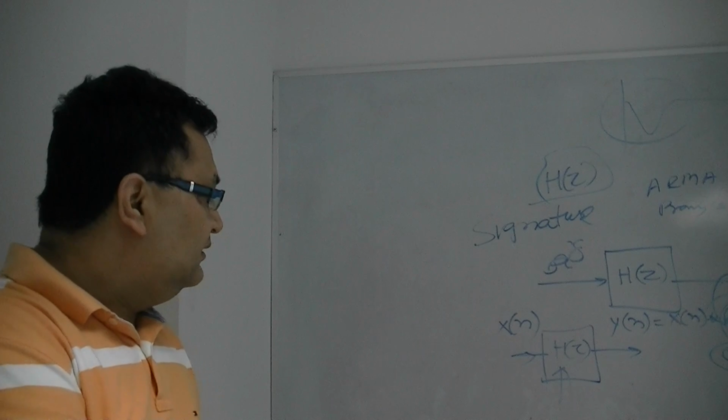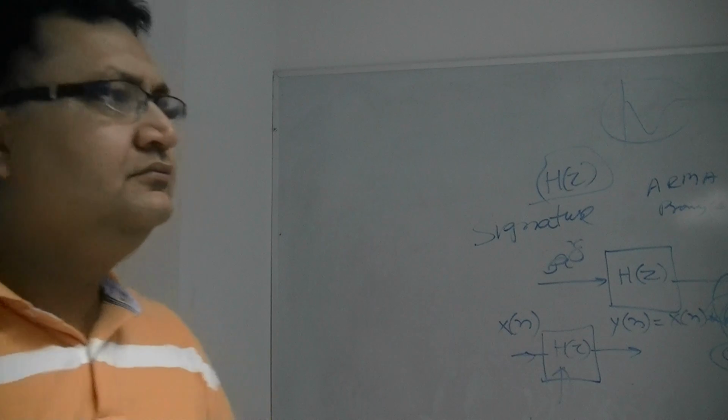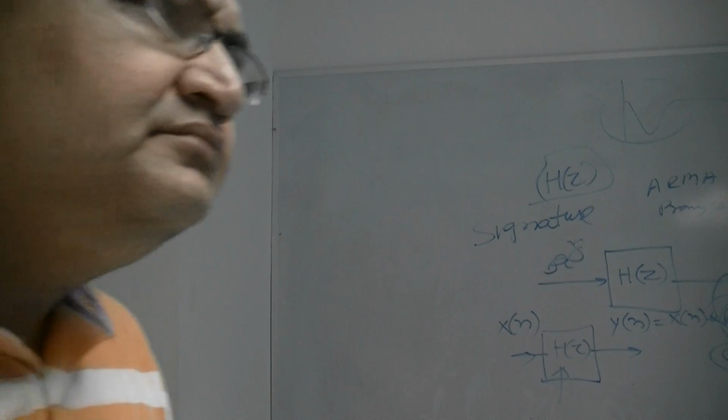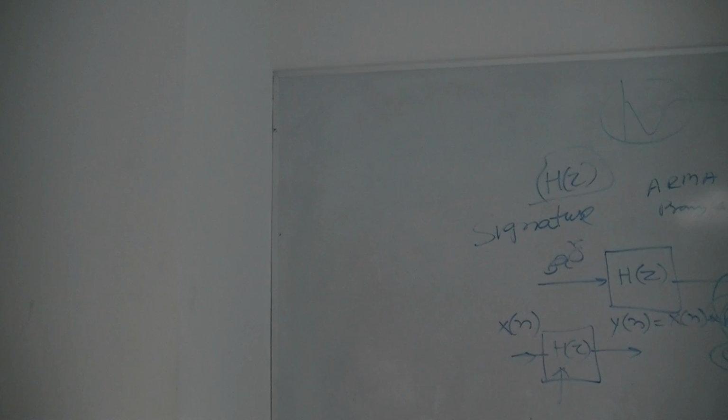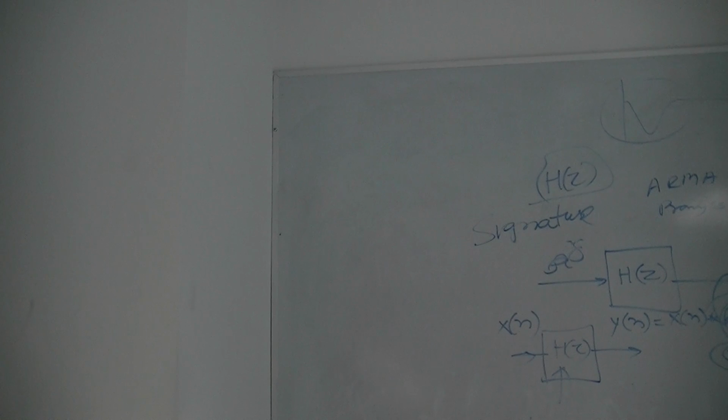And you found the model, or you're just working on that? No, I'm working on the coding. About the channels, does the order of the channels matter for the analysis? Right now I'm converting all this data into an Excel sheet and then reading that Excel sheet into MATLAB. So it is taking the data of all the channels. When there's a flickering of the eye, I start my timing of the data from there, say from 1 second to 3 seconds, 4 seconds, whatever, where there is the impact of that eye flickering.